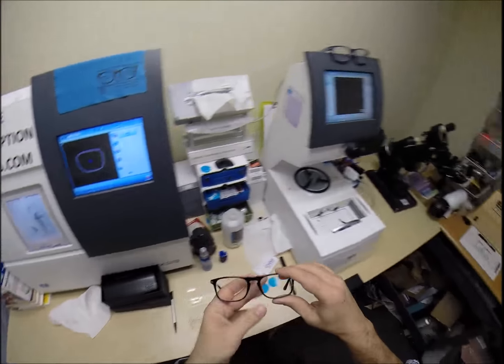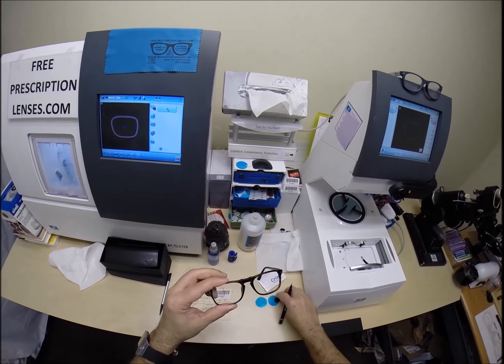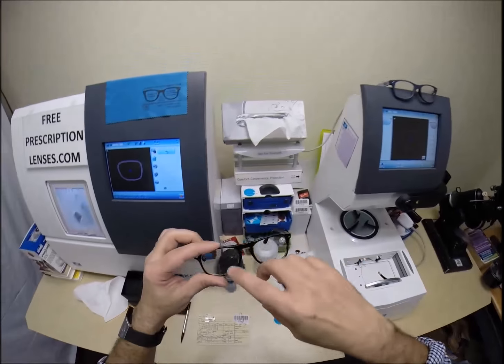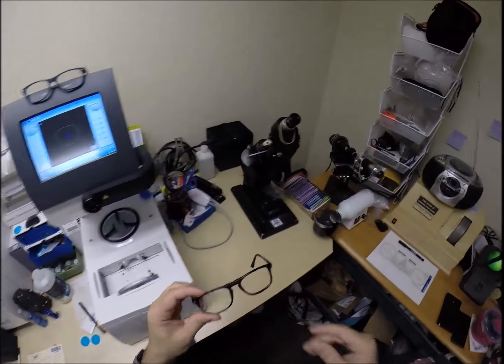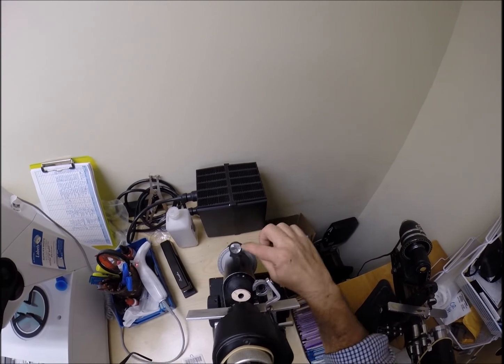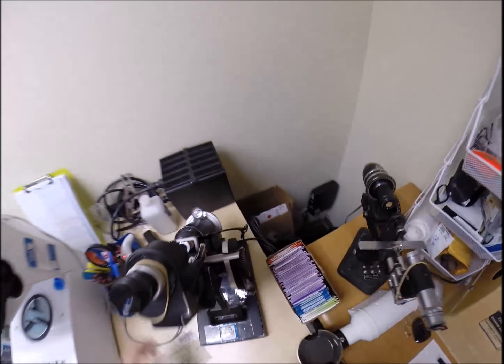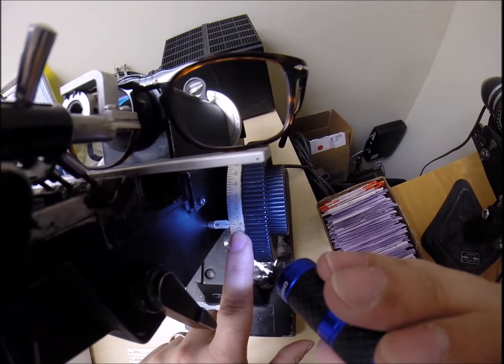You have the Crizal Sapphire and also Transitions Extra Active Brown to match the frame - also available in gray and the new graphite green. Most people like the lens color to match the frame color, so because this is a tortoise frame, this will be an extra active brown lens. Crizal Sapphire is the clearest of all the Crizal coatings. Crizal Provencia still blocks a little more blue light, but has a purplish hue that women love but not all men. The Crizal Sapphire is a much more masculine color with a blue to almost clear hue.